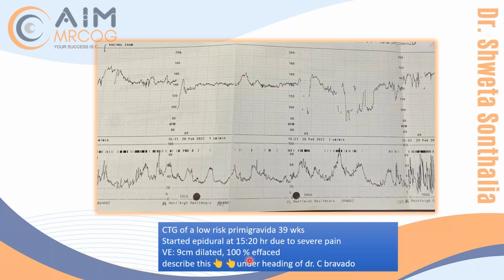It's a fun activity, isn't it? To read the numbers. If you see, this is a 1 centimeter per minute CTG trace. Vaginal exam here, she was 9 centimeters. Yes, come on, please. If nobody is interested, then... There is no risk, it is mentioned low risk.